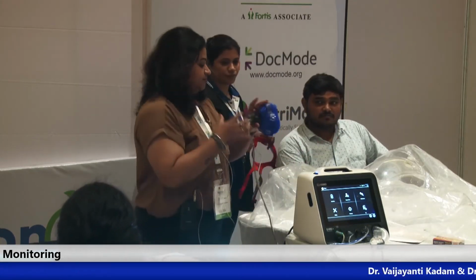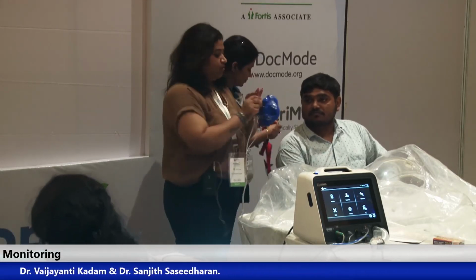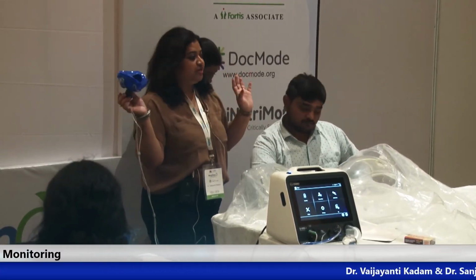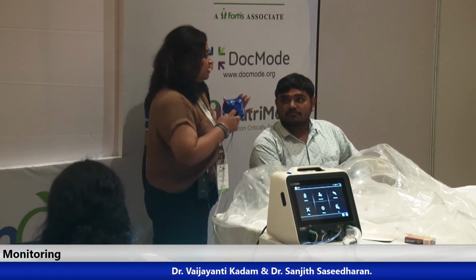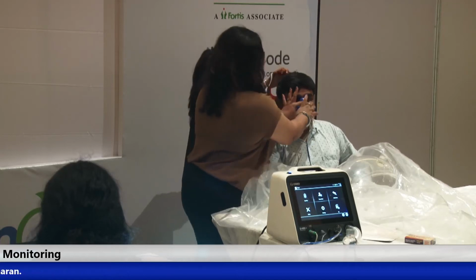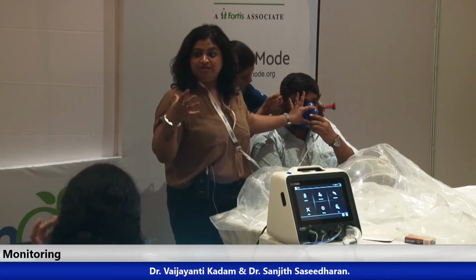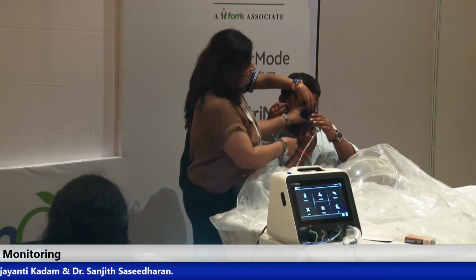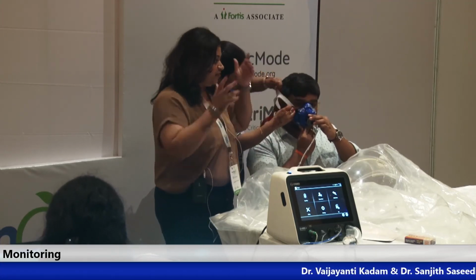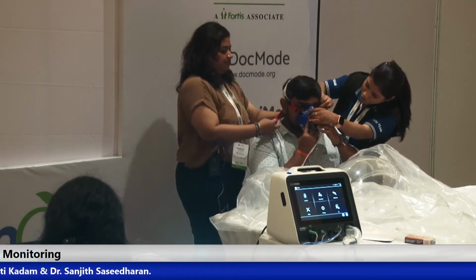Okay, so in this gentleman, we are going to use a mask mode. We can also use it when a patient is requiring around 2 to 4 liters of oxygen. We can use this as a mask on the ventilator. This is not going to create any kind of suffocation, the patient is not going to feel suffocated. No, not at all. There's a filter over here wherein he can breathe through very easily. There's no claustrophobia, nothing of that sort. So we attach it like a NIV mask.